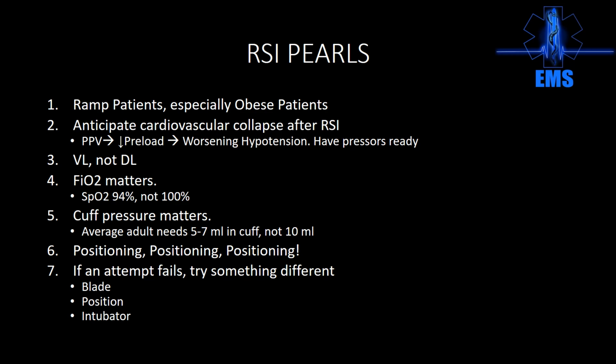So you need to sit the patient up and ramp them up. They need to be more than 30 degrees. They'll probably be closer to 45 degrees in order to overcome all that resistance from the tissue that's just sitting on the chest. You're going to limit their respiratory excursion, their ability of their chest to move up and down, if you keep them supine, so ramp them up.